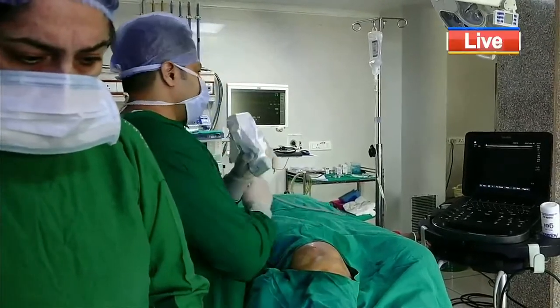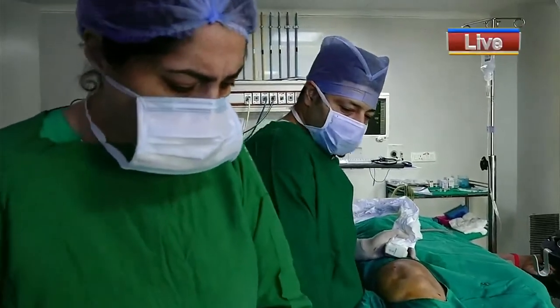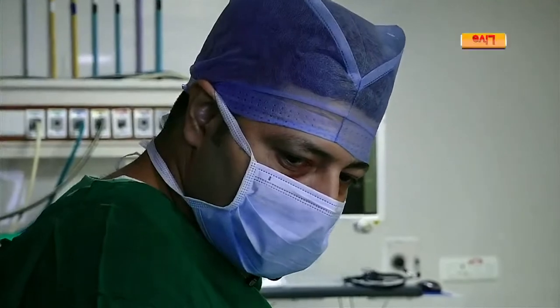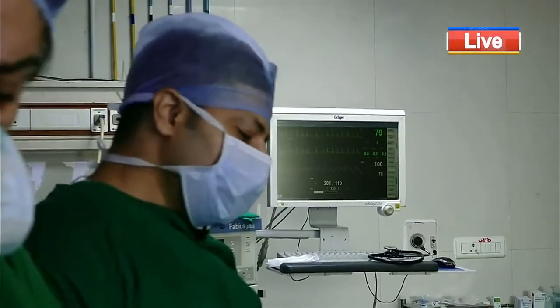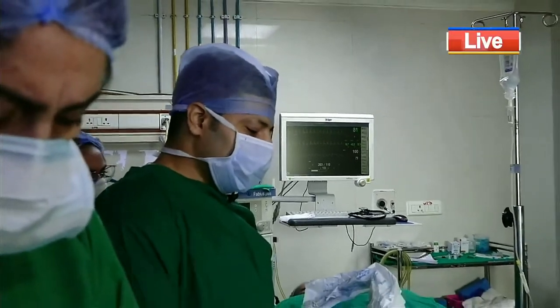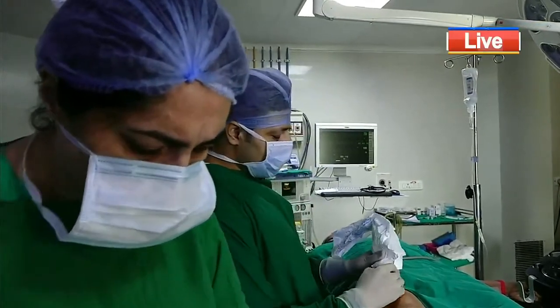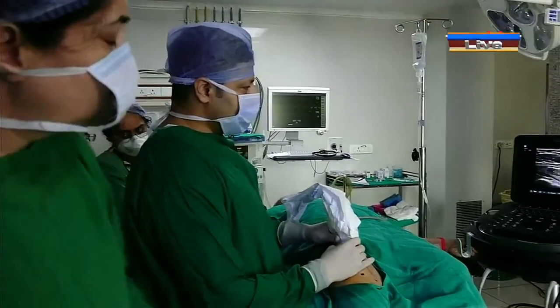So why did that line come? Because we had given the kenalog directly. If you are not very sure of your depth, you can give the local first a little bit, and then probably you can give the drug. For this we are aiming for a therapeutic result also, so we have given the steroid as well.